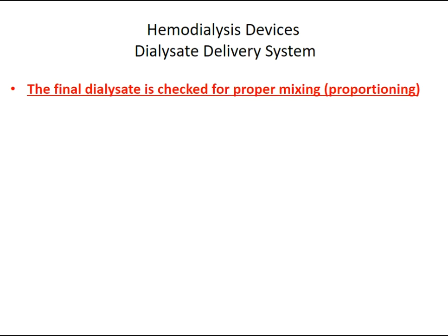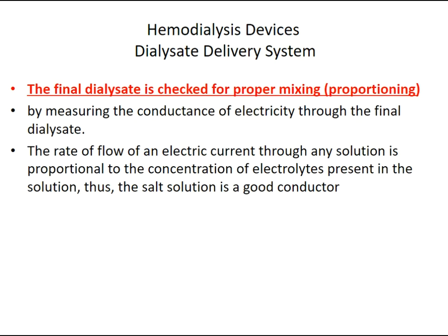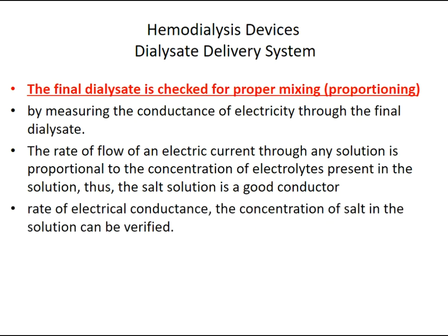The final dialysate is checked for proper mixing by measuring the conductance of electricity through the final dialysate. The basis of that is that the rate of flow of an electric current through any solution is proportional to the concentration of electrolyte present in it. So the salt solution is a good conductor. By the rate of electrical conductance, the concentration of salt in the solution can be verified.